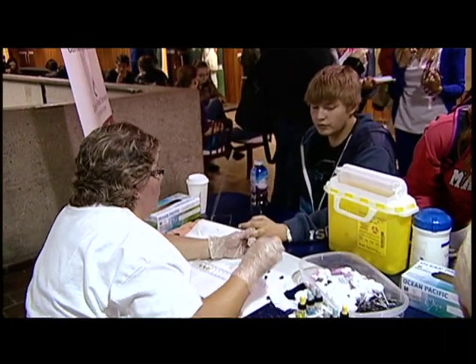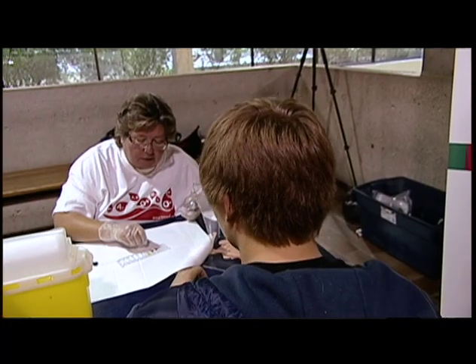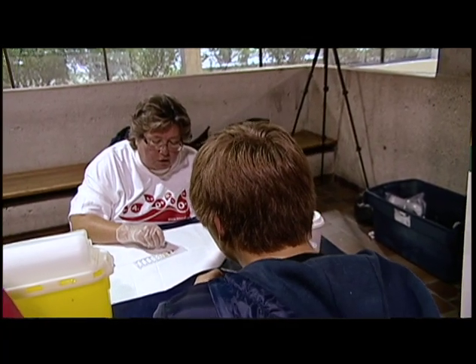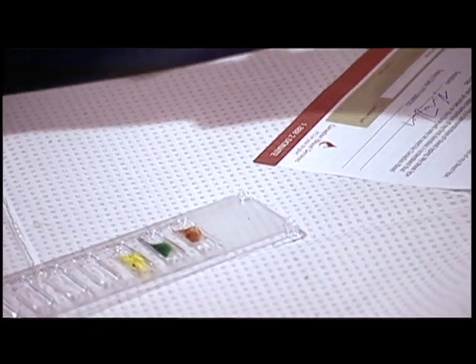All right, well, Darren is with Canadian Blood Services. So tell us a little bit about the blood type testing here and exactly what is happening. Sure. Basically, the blood typing station here, what happens is people will come in, we ask if you'd be interested in getting a blood type, and then you sit down and you get just a finger poke. And after we gently poke your finger, we take a few little droplets of blood, we mix it with some serum, and based on the blood clotting, we can tell you what blood type you are, so A, B, O, or AB.